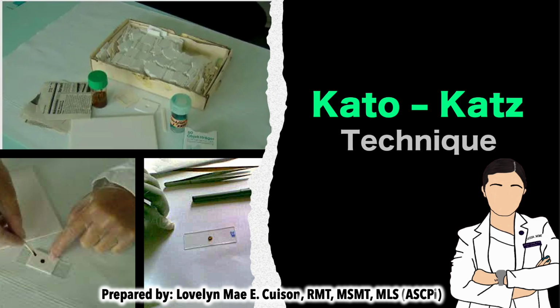The Kato-Katz technique, however, is used to assess the worm burden, or should I say the intensity of the infection. This is a quantitative method, of course, for detecting parasites like the intestinal nematodes. We also call it the cellophane covered thick smear.